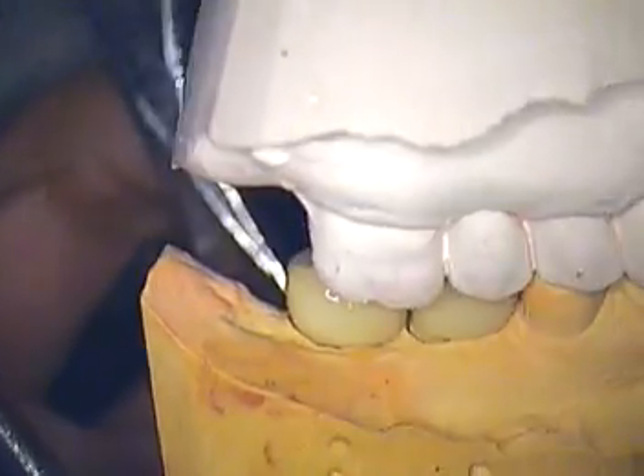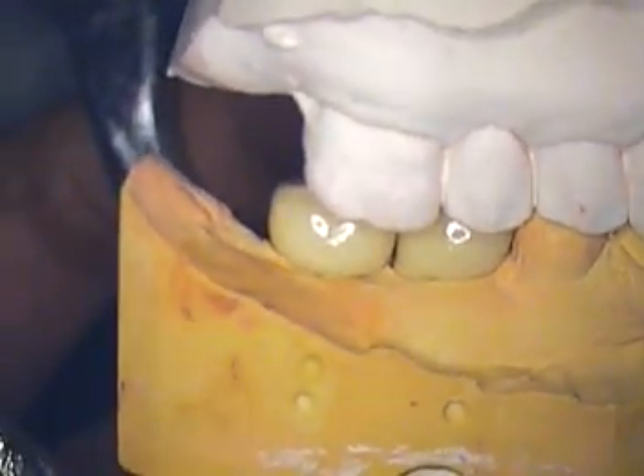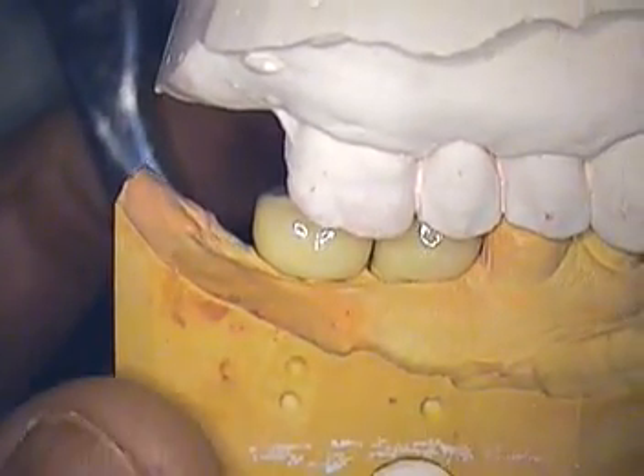Hi everyone, Dr. Jerry Cuomo here in Boca Raton, once again with a bone level case.